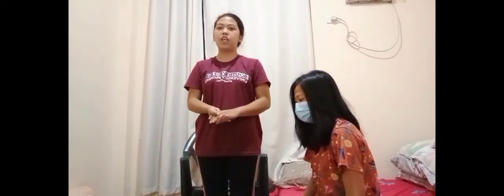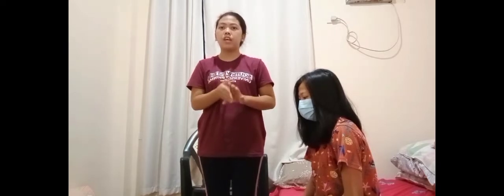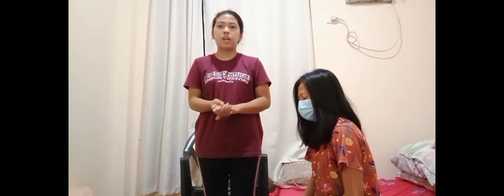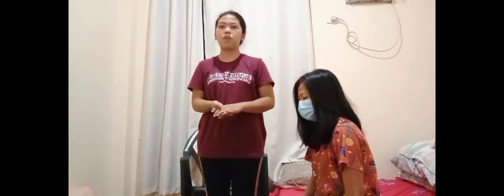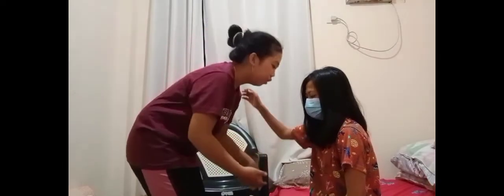Next, have the patient place their hands on your shoulders, on the mattress, or on either side of their body. Place your hands under the patient's arms and have your knees against the patient's knees as the patient stands. Can you hold on to my shoulder, ma'am? On a count of three, 1, 2, 3, go. Pivot your back foot until the patient feels the wheelchair or chair against the back of the legs, keep your knees against the patient's knees, move slowly, and have the patient grasp the armrest.